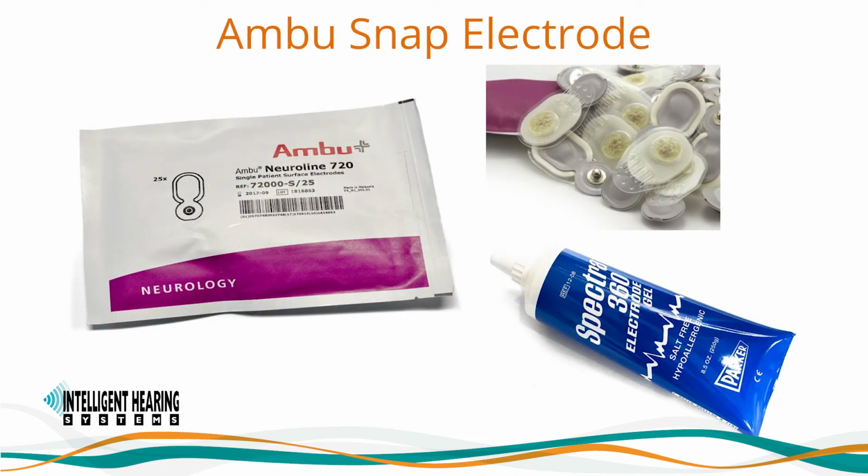You should use the skin prep pad to clean the skin area at each electrode placement site, as noted in the electrode montage. Make sure to dry the electrode placement area thoroughly. When placing the snap electrodes on the patient, make sure to press around the white edge of the electrode to adhere the electrode to the skin. Do not press on the center of the electrode where the sensor sponge is located, since this area is full of conductive gel. If pressed, the conductive gel may spread and compromise the adhesive area around the electrode, which can lead to a detached electrode mid-test. If impedances are high, remove and discard the snap electrode.